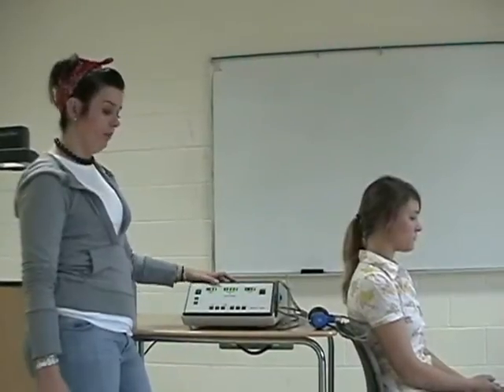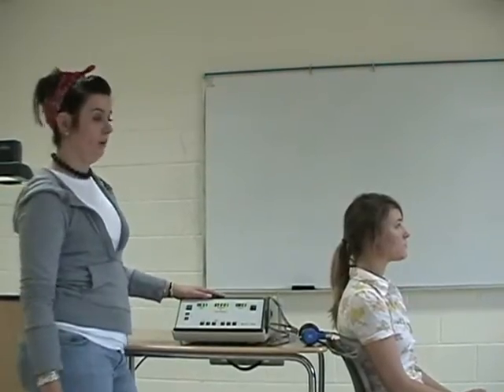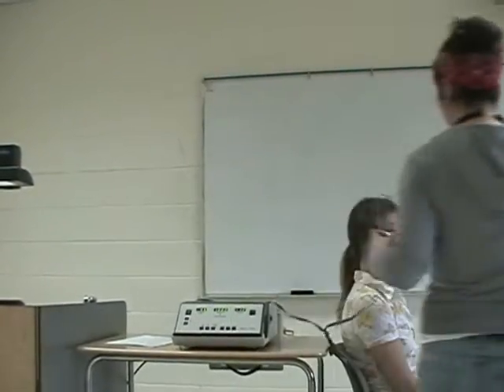When you're doing a hearing screening with a pure tone audiometer, you want to make sure you're in a quiet room with minimal background noise. You want to sit the patient in front of you but facing slightly away so they can't see what you're doing with the audiometer buttons. First, you want to let them know that this is not a hearing test but instead a hearing screening. Then you want to put the headphones on them comfortably.